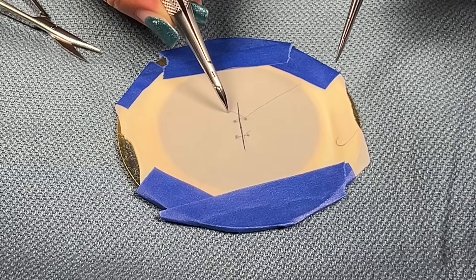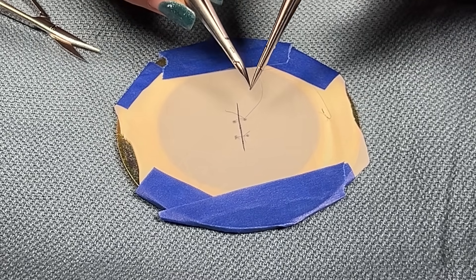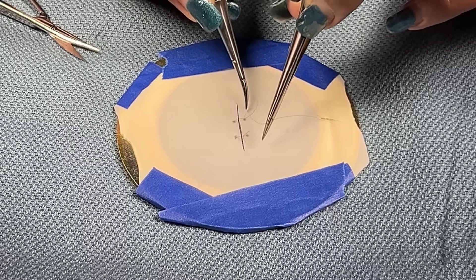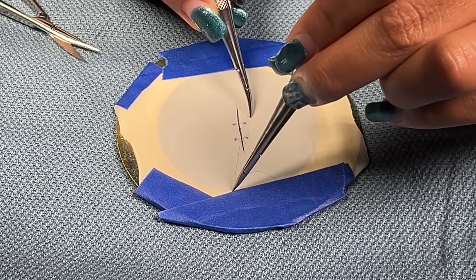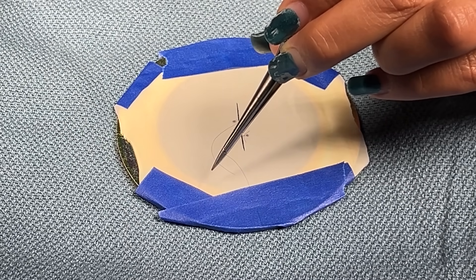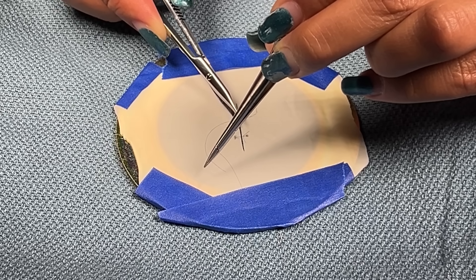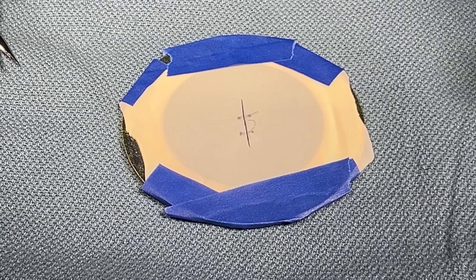And then the long end is going to loop around towards the tail end. The driver's going to go under over. I'm going to grab the tail and secure the back. Once you've done three knots, you're going to cut the long end. That's how you sew.